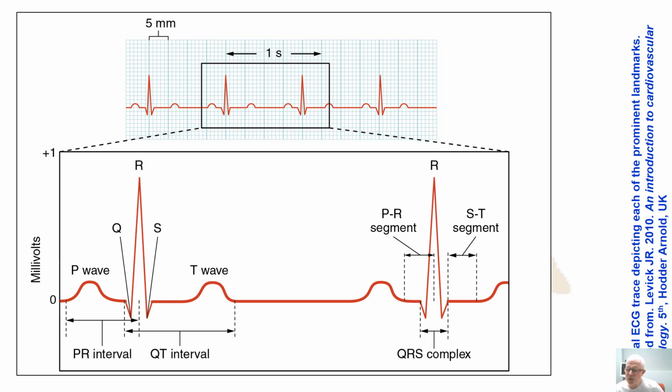So all of these responses relate to key activities in the heart. In other words, they relate to those time intervals that we saw on the previous slide, and therefore must relate to key actions within the heart. In other words, whether the ventricles are being innervated, whether there's a repolarization of the heart, whether it's relaxation, and so on and so forth.